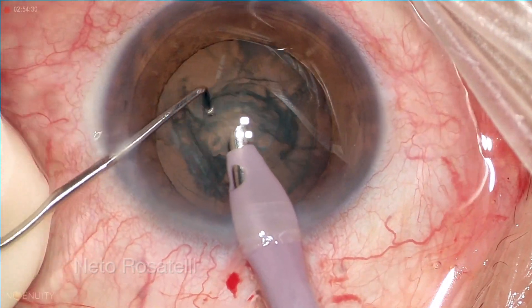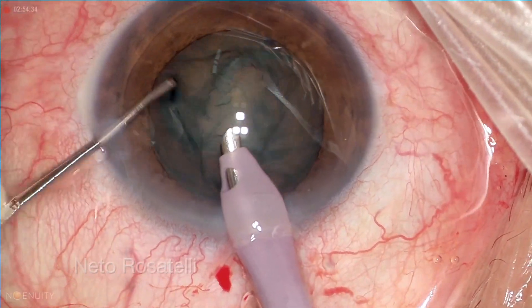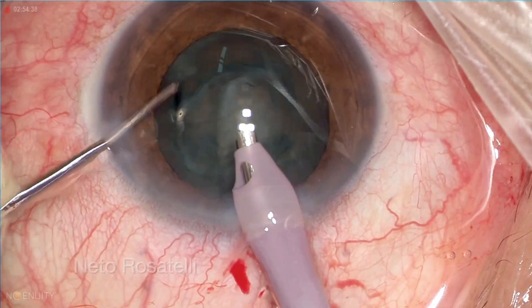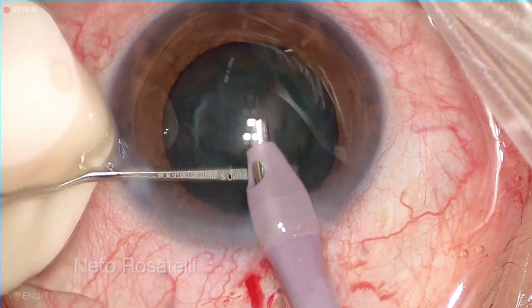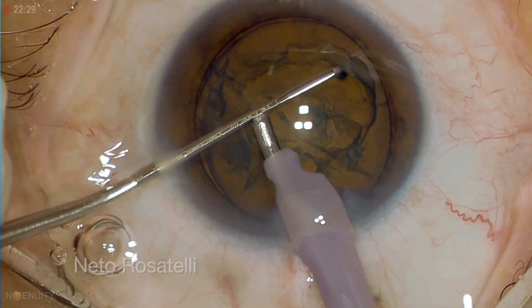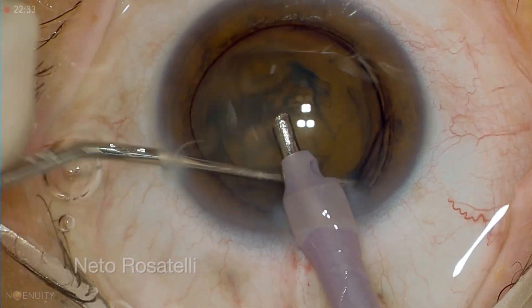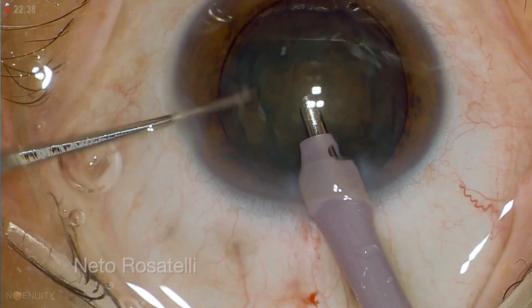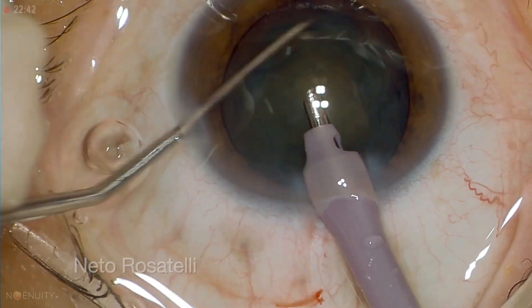Let's see some spin examples. As you can see, clockwise rotations and then counter-clockwise ones. The farther away from the center you push the nucleus, the more grabbing power and control you have, but always respecting the rhexis margin.